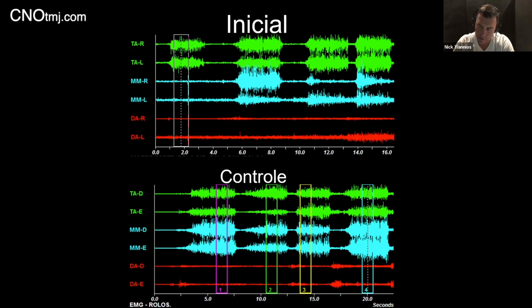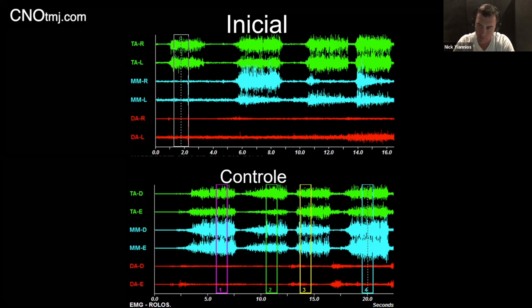Yes, so let me ask you another quick question. How often would you typically be changing? I know it's going to be different for every patient, but you'd have a patient back every, what, about 3 months to do new data gathering? In general, a typical TMJ pathology treatment lasts around 1 year. Actually, 11 months is the median point, the mean. And I see the patient around 4 to 6 times over that time.